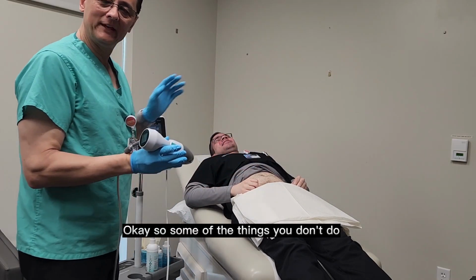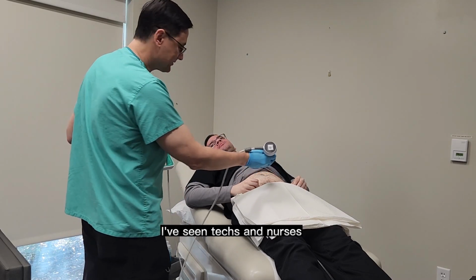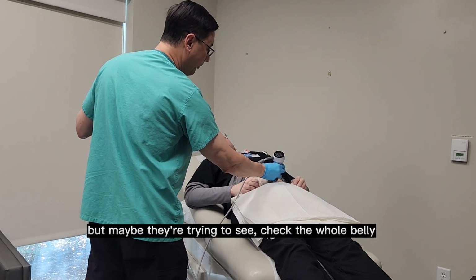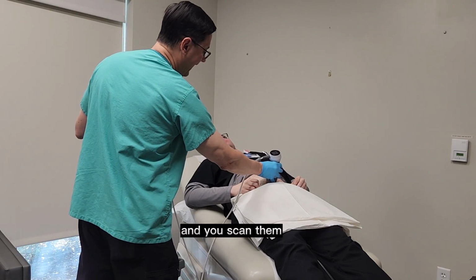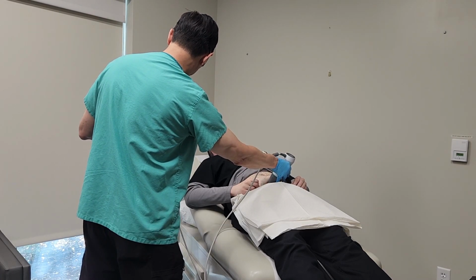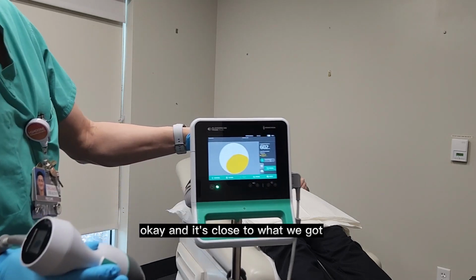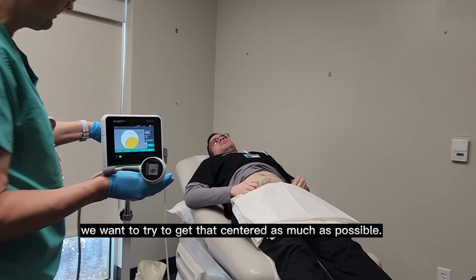Okay, so some of the things you don't do, and these are things I've actually seen on the floor. I've seen techs and nurses scan like this. They're moving that wand all around. I'm not sure what they're trying to accomplish, but maybe they're trying to check the whole belly, but that is not how you scan someone. You find the place that it's supposed to be in and you scan them. So I'm going to do an off scan one time here. As you can see, I'm intentionally tilting it sideways, okay? And it's close to what we got, but you can see it's still not accurate. So again, we want to try to get that centered as much as possible.